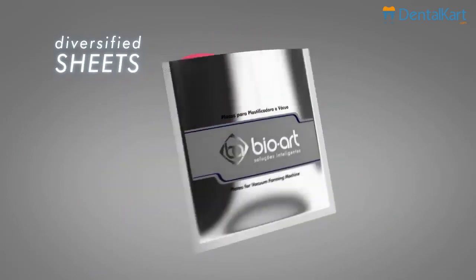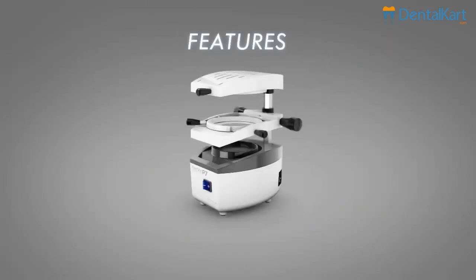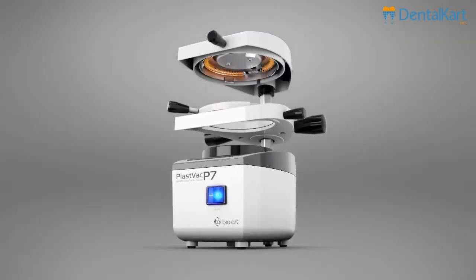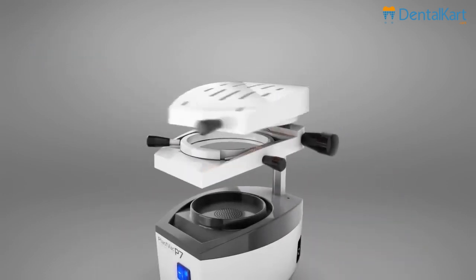To ensure its integrity, the sheets are vacuum packed with moisture protection material. The PlastVac P7 is equipped with a carbon fiber element, providing a fast and uniform heating.